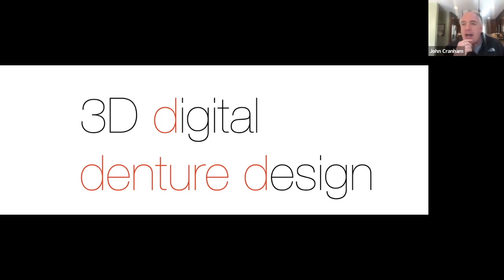I tried to bring the data files, both the CT and the face scan, out of CareStream, and there were some little glitches with it, but I also don't have any experience doing that. So we're going to send that down to Lee and see if that works. But the answer to your question is they are definitely starting to do that. And I think it's a genius way to do it, because then the CT and the face scan are pinned against one another. So you don't lose any of those relationships.